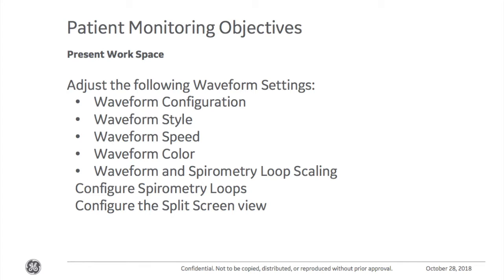After watching the video, the viewer should be able to, from the present workspace, adjust the following waveform settings: waveform configuration, waveform style, waveform speed, waveform color, waveform and spirometry loop scaling, configure spirometry loops, and configure split screen view.